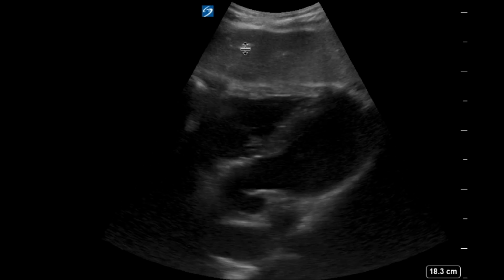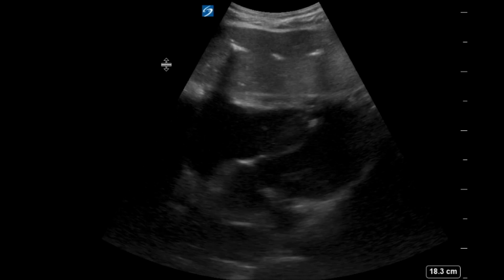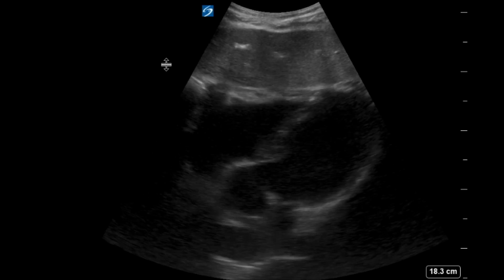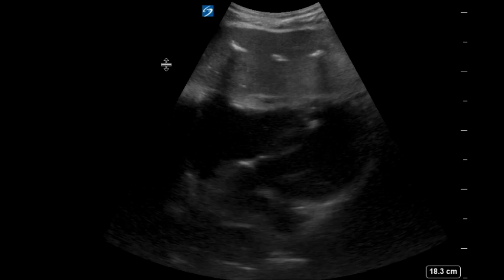So why, though, do you think, based on the patient's history, he may have air? So I guess for this individual with his history of surgery and the connection between the liver and the jejunum, there could be air within the bowel that is backflowing or backing up into the liver, and to be expected, I guess, in this individual.